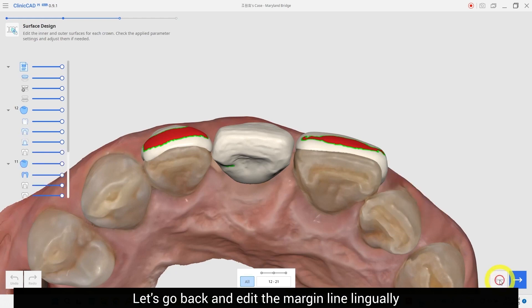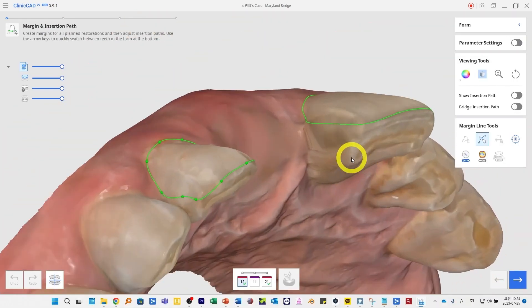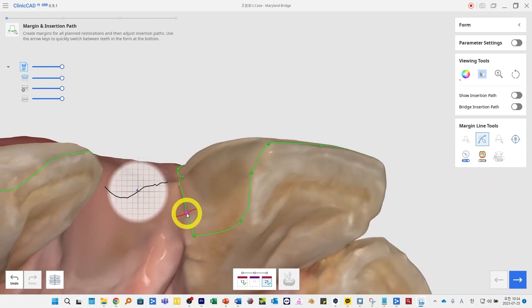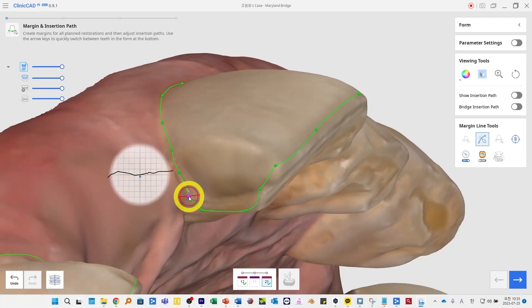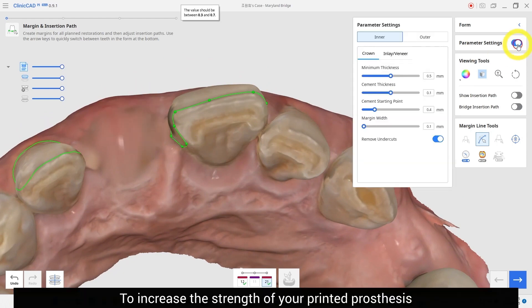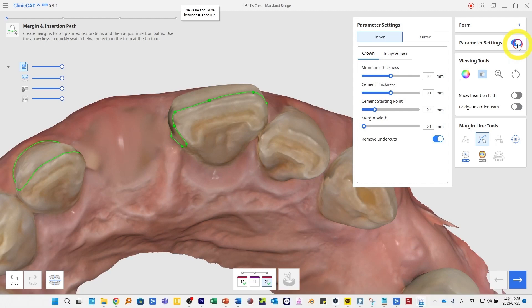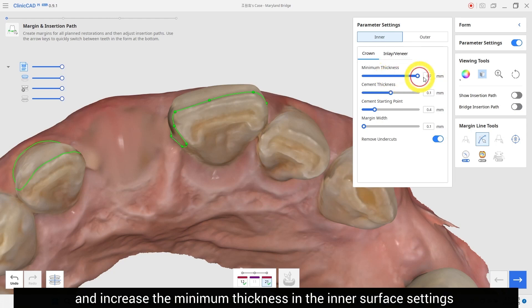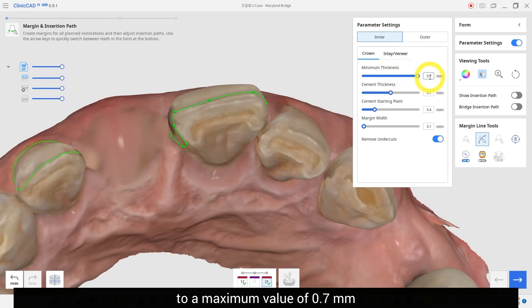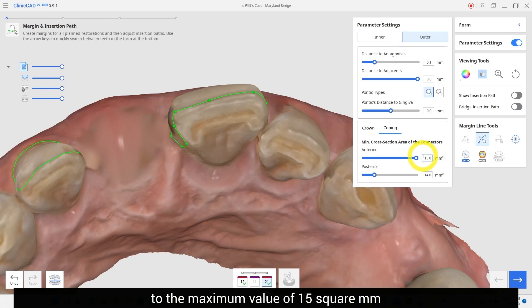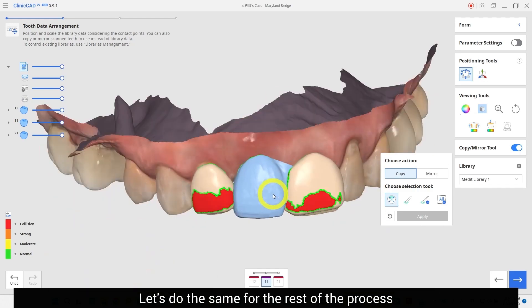Let's go back and edit the margin line lingually. As I mentioned before, by placing the margin on the lingual side beyond the contact point, you can reinforce the weak connection. To increase the strength of your printed prosthetics, I recommend changing the following settings: go to parameter settings and increase the minimum thickness in the inner surface setting to a maximum value of 0.7 mm. Also modify the area of the coping connection in the outer surface setting to a maximum value of 0.15 mm.